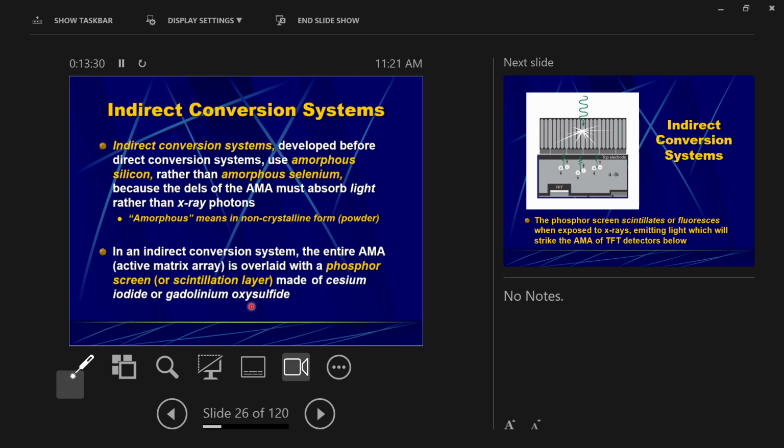So very long ago, when we first started doing this, we learned that. Old cassettes used to be just a piece of cardboard, a big black covering of cardboard. You put a piece of film inside the cardboard and took your X-rays. But very quickly, we realized that it takes a lot of X-ray exposure to expose photographic film. Photographic film responds better to visible light.